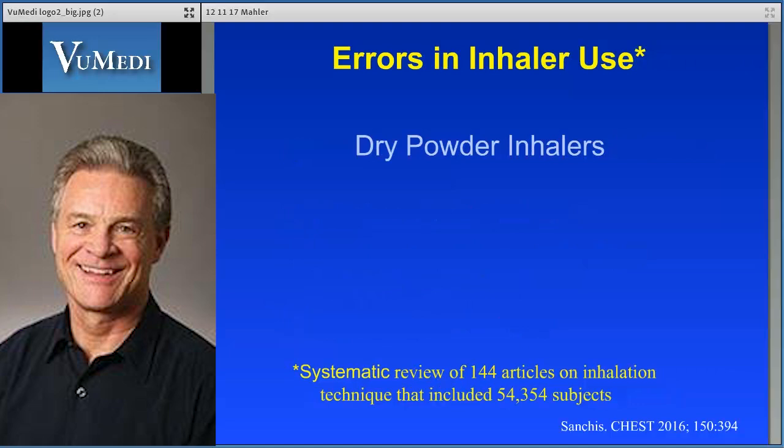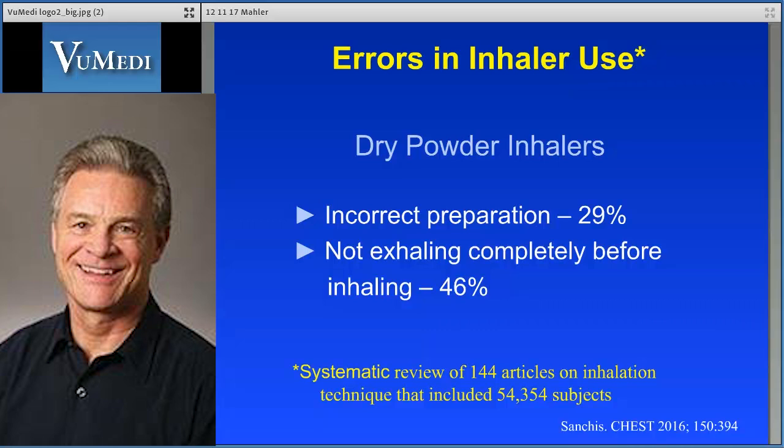There are also errors in dry powder inhaler use based on the same systematic review. 29% had incorrect preparation of the dry powder inhaler. 46% did not exhale completely before inhaling. And there was no breath hold in 37% of subjects.